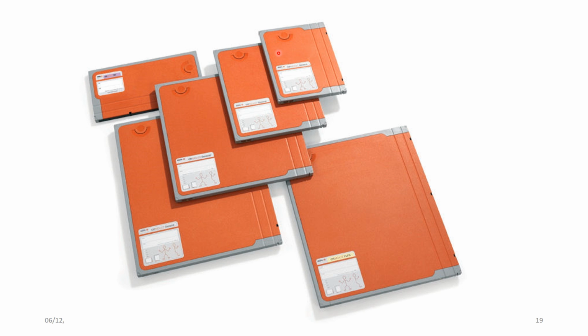So these are what they typically look like. You've got various sizes. So this is your 18x24, I think it's centimeters, your 24x30, weird size, and then 35x43, typical thing. And this is another weird size one here. This is the OPT machine one, which is ultra wide essentially. I don't know about this. I'm sure that's just a weird Photoshop thing when they're stacking them, but I'm pretty sure that's just a weird size. It might be a skull unit size. Couldn't tell you, to be honest.